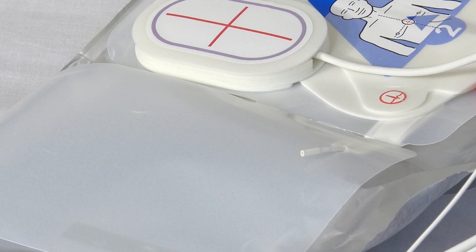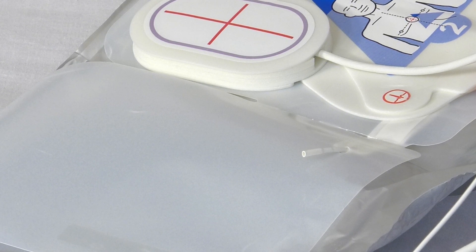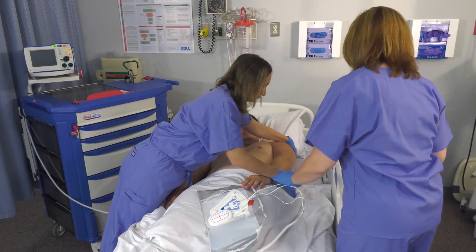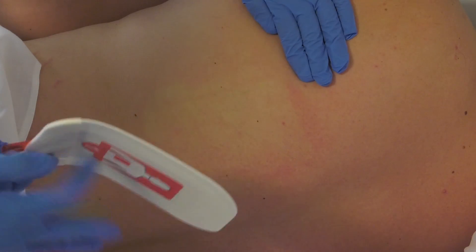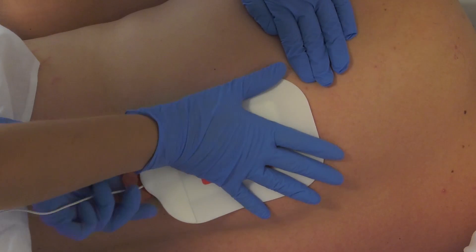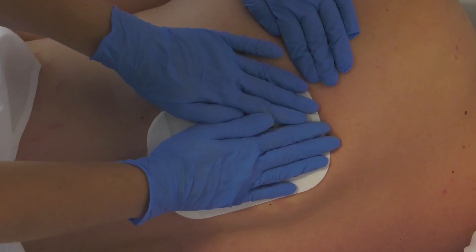The self-test connector only works when the electrode packaging is unopened and attached to the R series. Roll the patient onto their side, then roll the electrode onto the patient's back to the left of their spine and under the scapula.